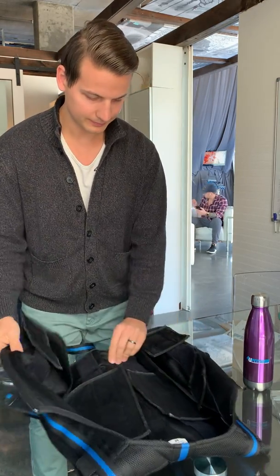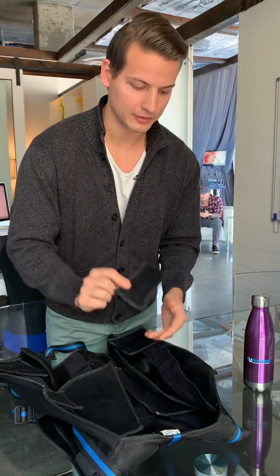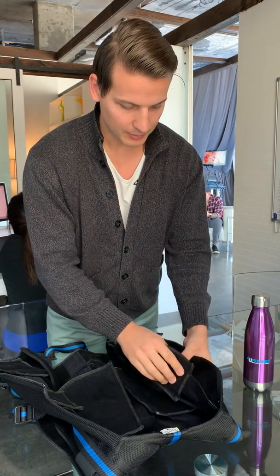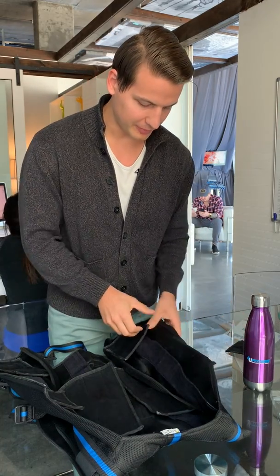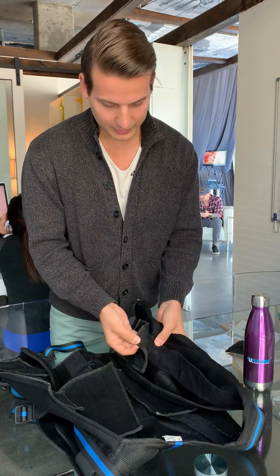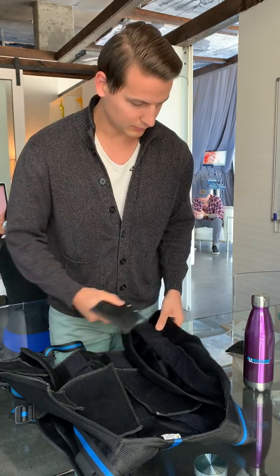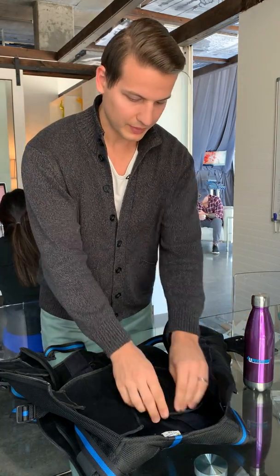I have already taken out all the cables. Now I have to remove the electrodes, but you have to be very careful when you remove them. Make sure when you pull it, you carefully pull it from the Velcro — each one of them.